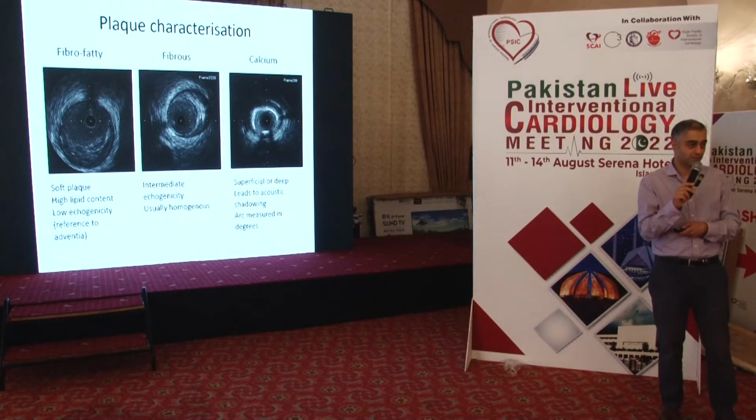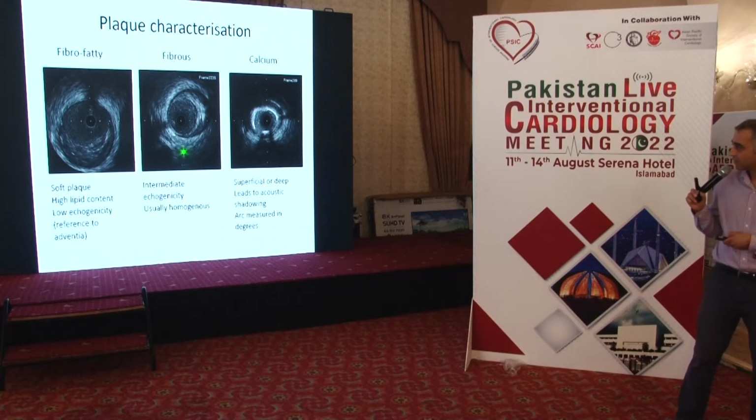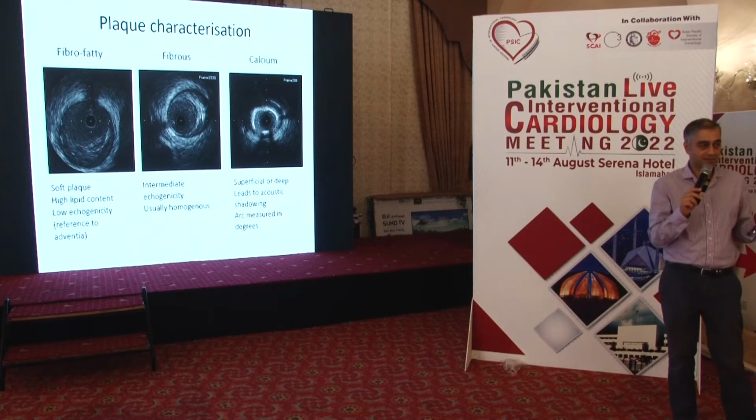So I don't know, a lot of you were already at the rota session that we ran just earlier. But here you can then make some judgment about the extent of calcification, and also whether it's superficial or deep.